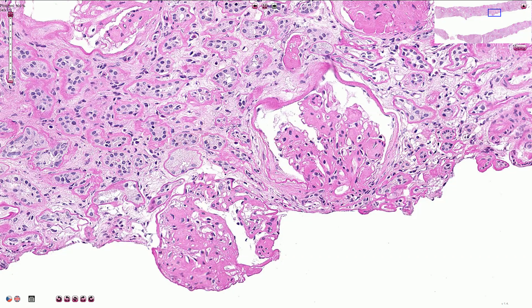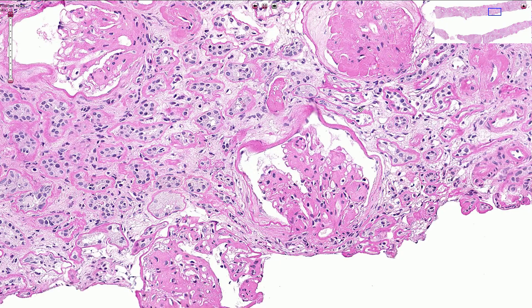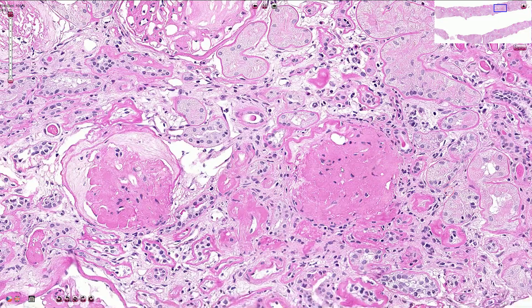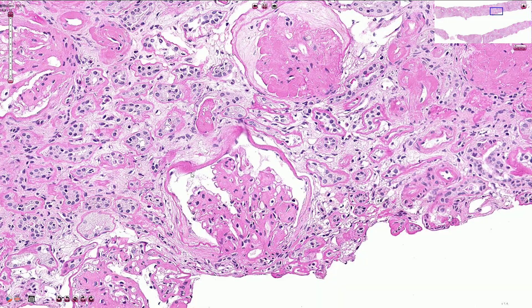Here we have another example of glomeruli with Kimmelstiel-Wilson nodules, and over time this can progress to complete sclerosis and destruction of the glomerulus, which can be seen here or here. This is complete hyalinization and complete destruction of the renal corpuscle.